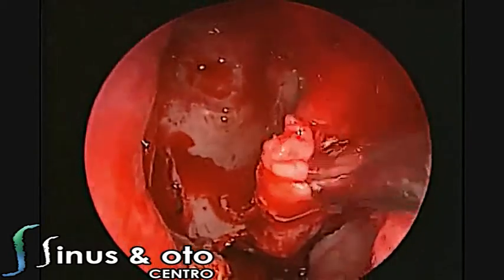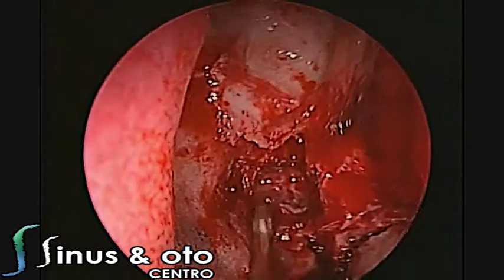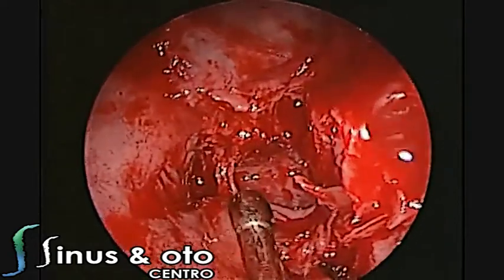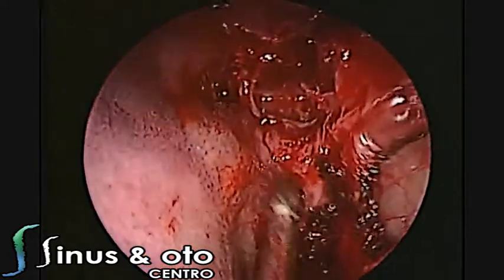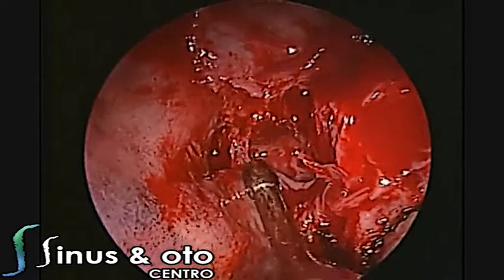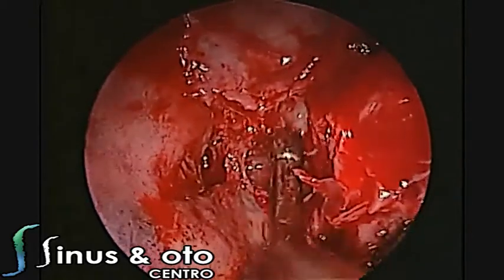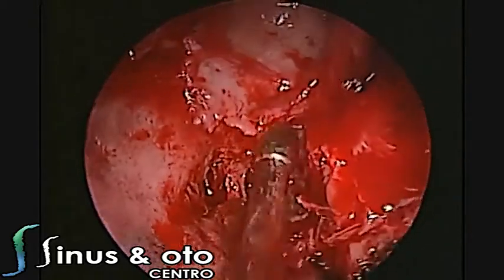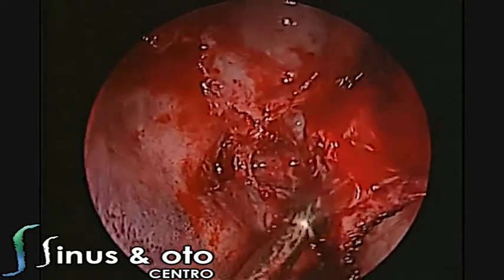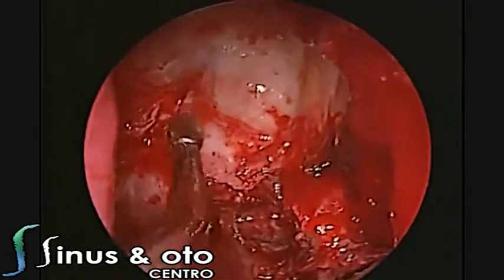We also remove the remaining parts of the mucocele sac, and we inspect the posterior ethmoidal cells and the sphenoid sinus in order to open them and avoid any postoperative complications regarding sinusitis or obstruction due to not opening those sinuses.